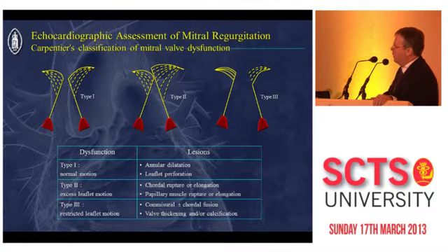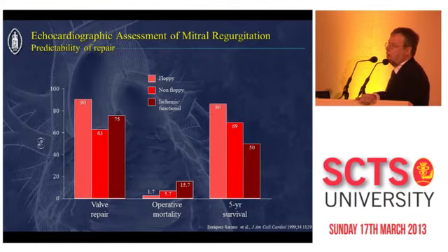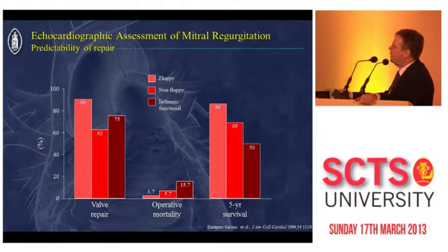So this classification has an impact on repairability. And once you evaluate the patient before the operation, this is probably the most important thing to do, particularly if you want to tackle an asymptomatic patient. The valve should be repairable. You will not replace a valve in an asymptomatic patient. And you see that the type 2s here, called floppy by the Mayo Clinic people, are repairable in 90% of the cases, and that was in 1999, so it should be close to 98% of the cases right now.